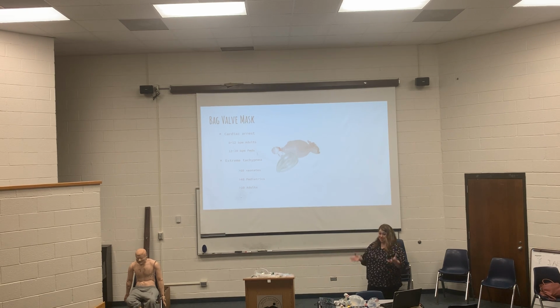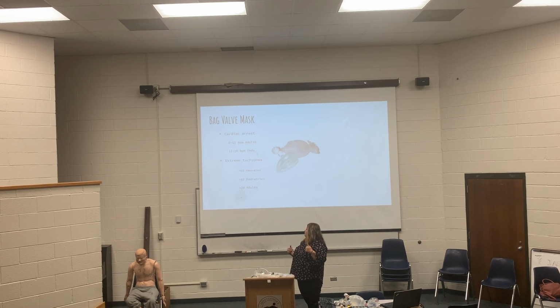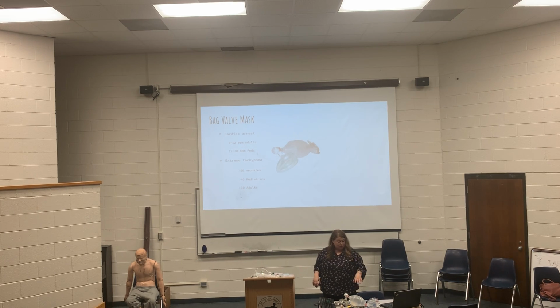I mean, you kind of get your general impression, but if they're not effectively perfusing, you cannot perfuse when you're breathing that fast. But if they're not perfusing as well, you can kind of reset their breathing, and their body will kind of adjust with it. So you set the rate, and as you assist them, you see them start to breathe. Of course, you don't want to do it 30 times, but you bag with them.